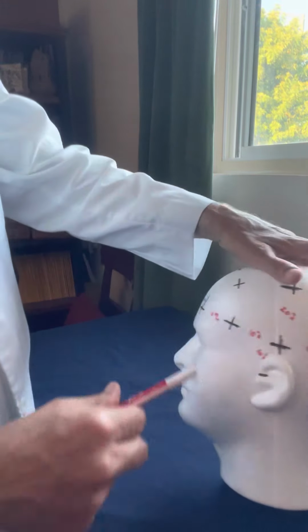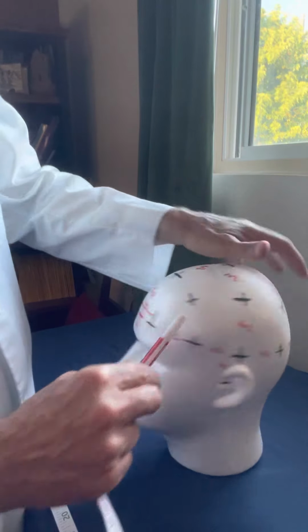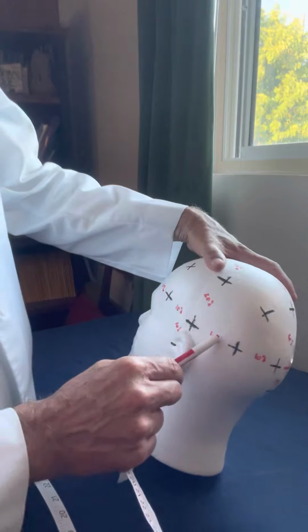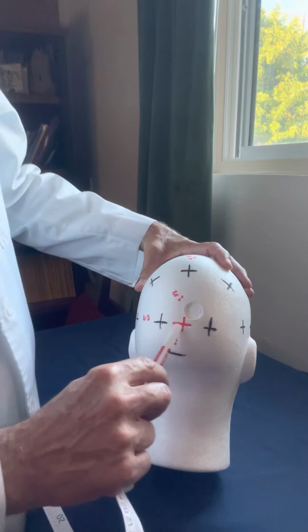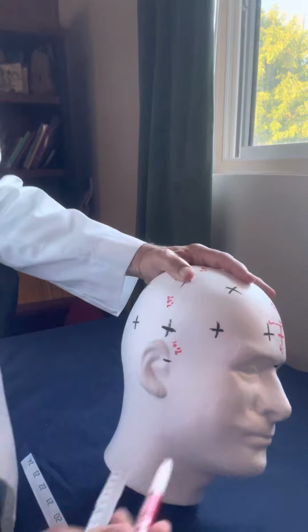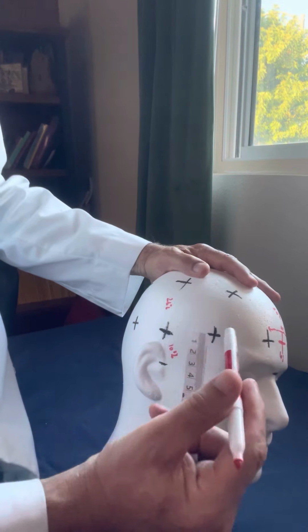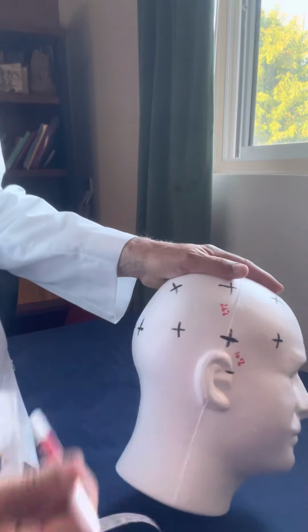Now if we take the frontopolar transverse plane, that's 10%, and we keep going around, that's 10, 20, 30, 40, 50. And then if we go from O1 to O2, another 10%, that's 60. Now if we go to the right temporal plane, going between each electrode, 10% each, that'd be 70, 80, 90, 100%.